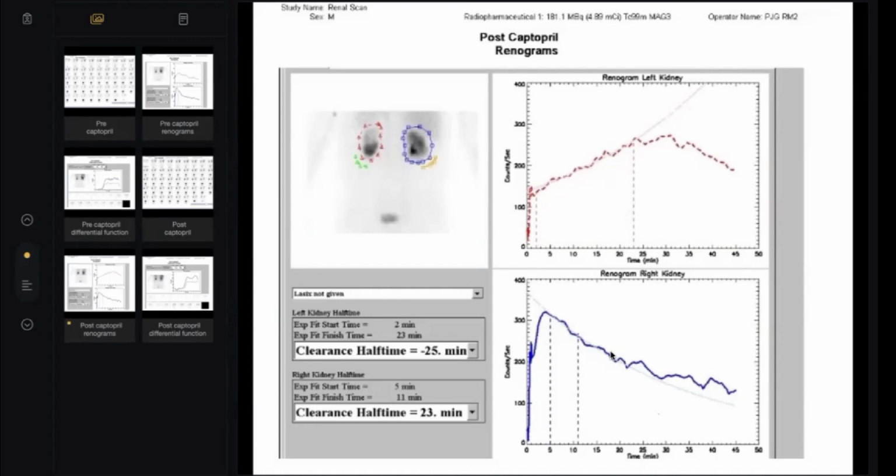Okay, my colleague, sorry to use this layman language, very simple language, but I think it is better to facilitate all these parameters and the complexity of the renogram. So, doctor, what happened here? Let's talk in the radioisotope buzzwords.